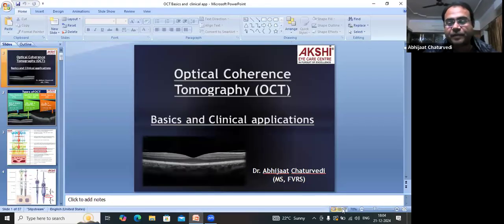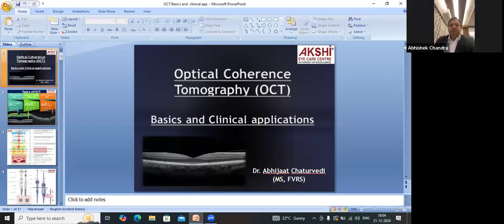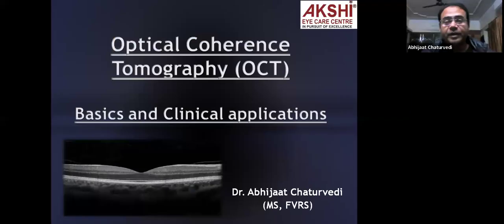Thank you, Dr. Abhijat. Thank you so much, sir, for the kind introduction. And yes, definitely OCT is something which is actually an art form. To read an OCT, it gives you loads and loads of information about the disease process that's happening. So before I begin my presentation on OCT, just a second, I'll just set this so that it doesn't disturb us.